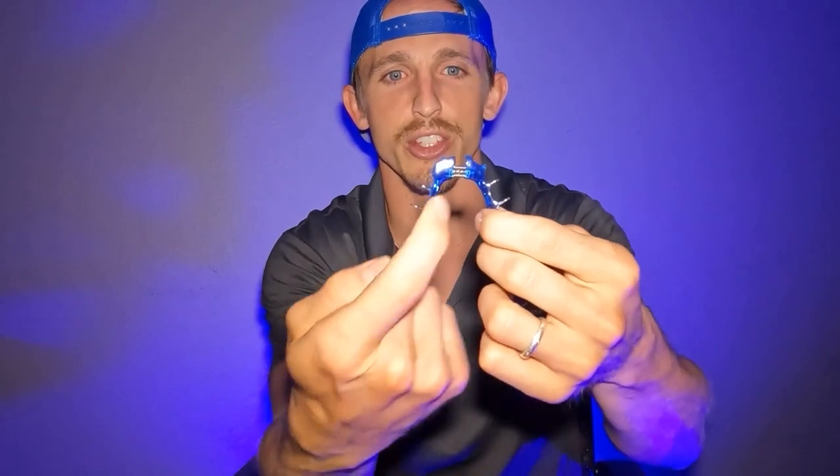There's also an expander for the bottom. This is called a Schwartz appliance. It has cool colors and similar components like the screw in the middle. You use the same key, insert it into one of the holes, and then you turn based on how often your orthodontist instructed you. What it does is it pushes those bottom teeth out. The bottom expander doesn't really change the base bone as much as the top expander does for the top bone.